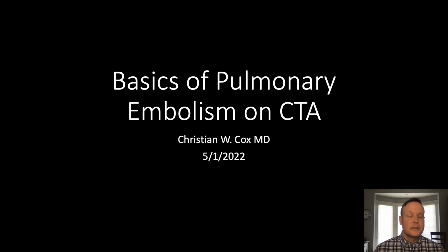Hi, I'm Chris Cox. I'm a thoracic radiologist at Creighton University, and I'm just going to talk to you a little bit today about basics of evaluating for pulmonary embolism on CTA.